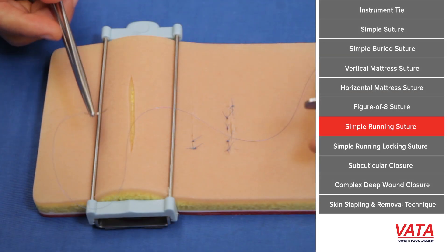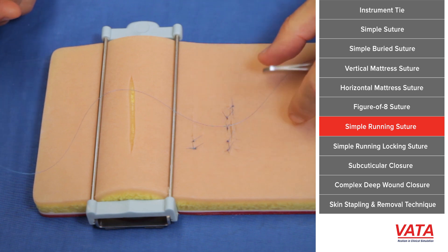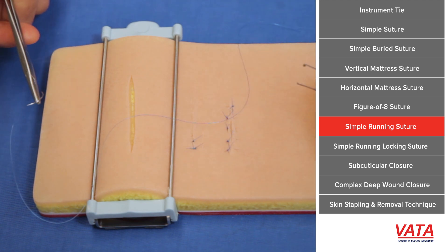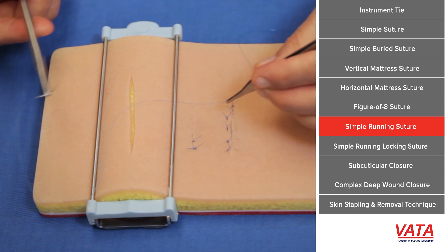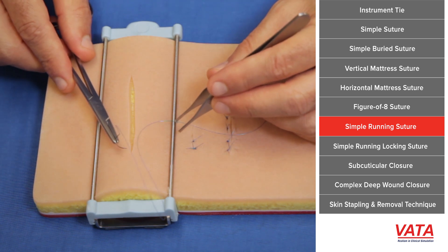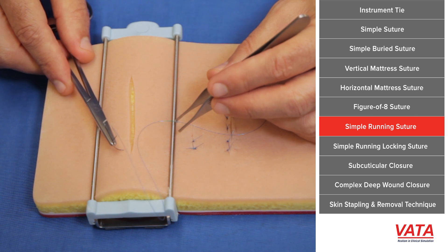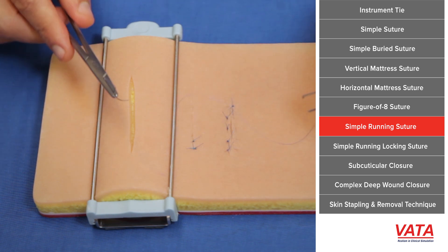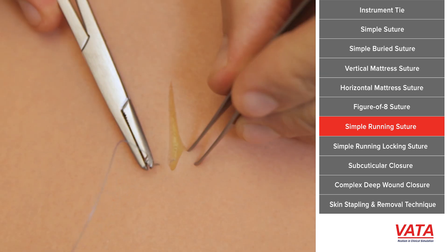Next, simple running suture. Now we're moving along — you're becoming a proficient suture with your simple sutures. You could just put a series of simple sutures and close a wound much faster. I liken this to a sewing machine. You'll want to take the exact same bite each time and advance the same amount each time, and that's how you get a closure to look pretty.